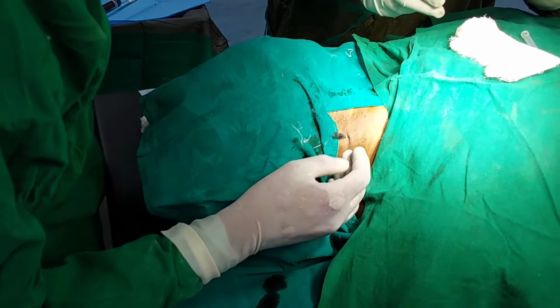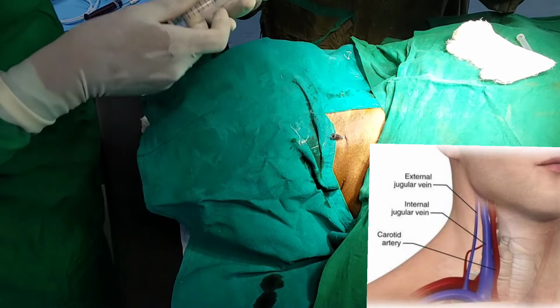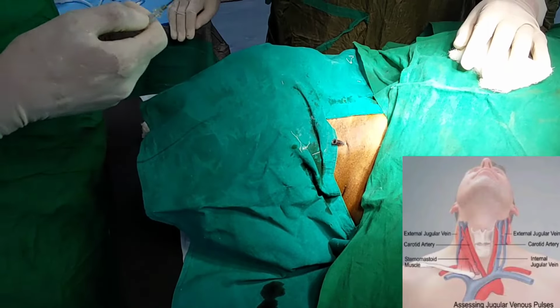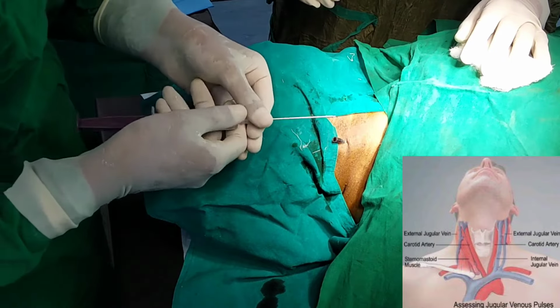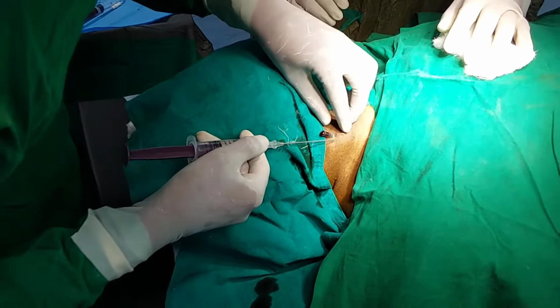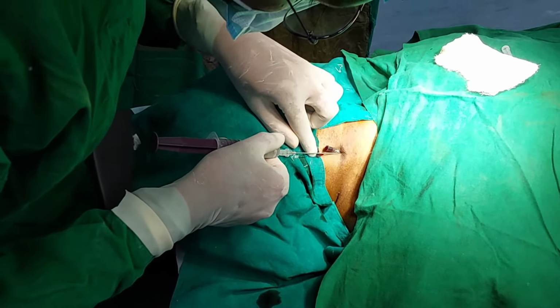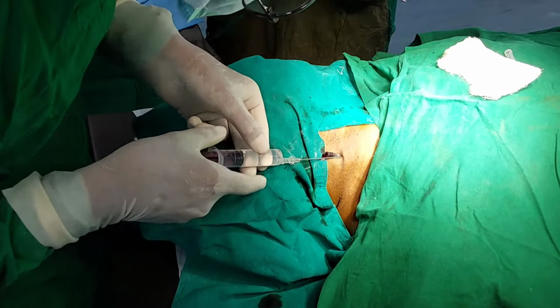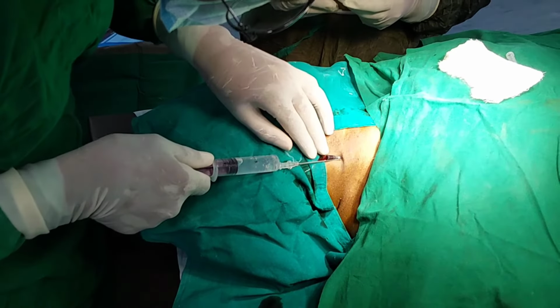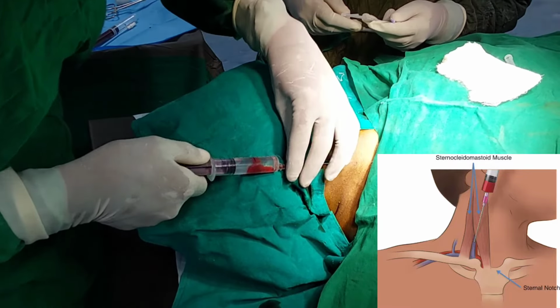Inside the triangle, the internal jugular vein lies nearly 1 cm lateral to the carotid artery, so palpate the carotid artery and go nearly 1 cm lateral to it. You can see in this video that I have palpated the carotid artery and then the introducer needle is inserted lateral to it with negative pressure. You should insert it with slow movement.